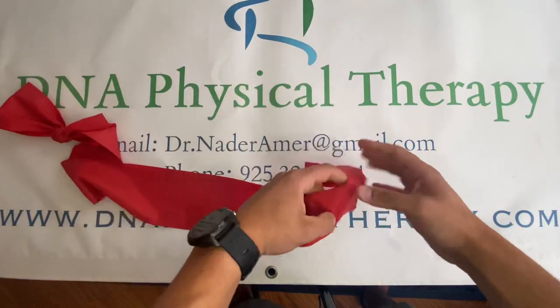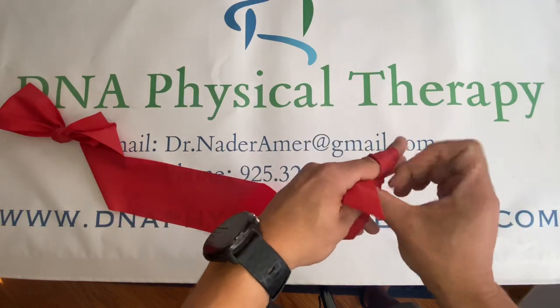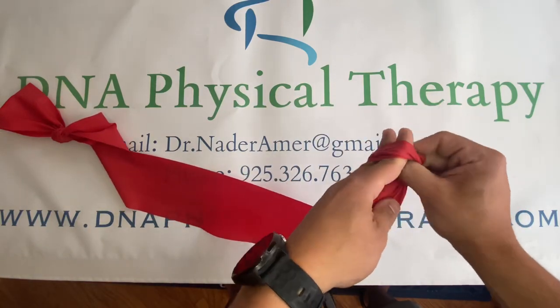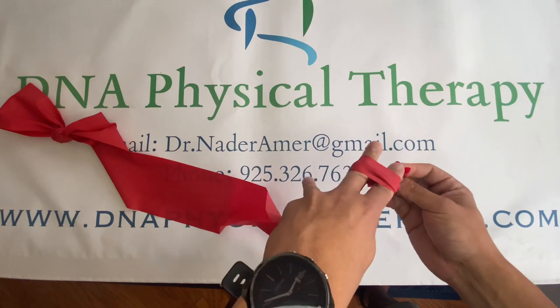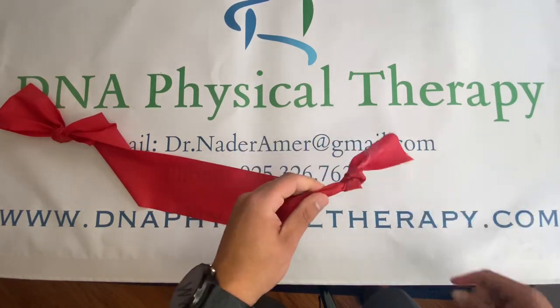Let's go to the opposite end. Make a little knot that goes in the door. Tuck it in. Just a simple knot. And pull taut.